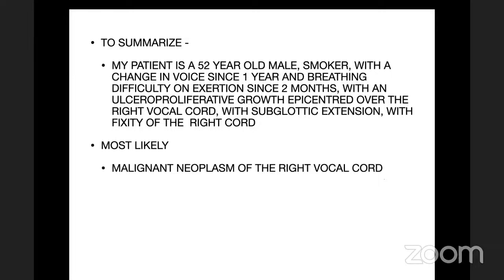Go ahead, Sarvani. Labdi, in this case, you've got a tumor which you think is at least a T3. Now, in this kind of tumor, do you want 1 millimeter cuts? What additional information would 1 millimeter give? Here essentially you want to know about the extent of disease, and whether this patient will or will not be a candidate for organ preservation. So what are you interested in looking at? A 1 millimeter cut today may be a little too much.